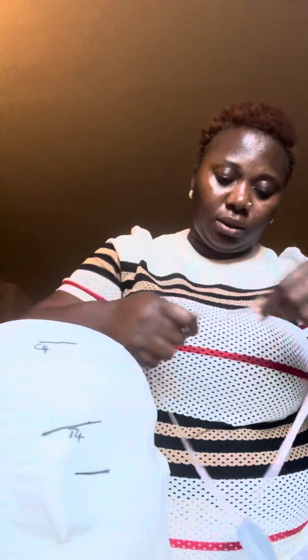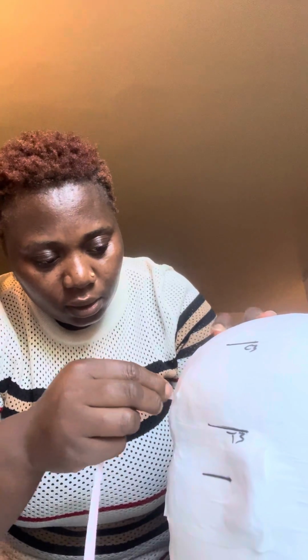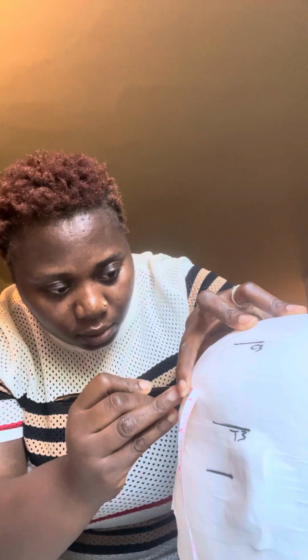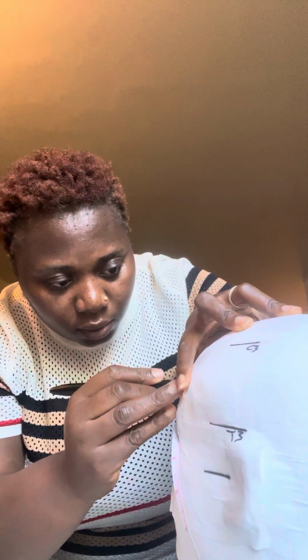So your true OZ will be 26. So 10%. Your FP is 10%. FP will be 2.6.